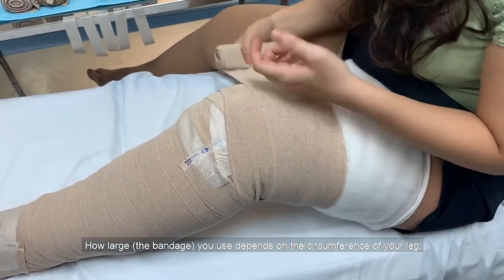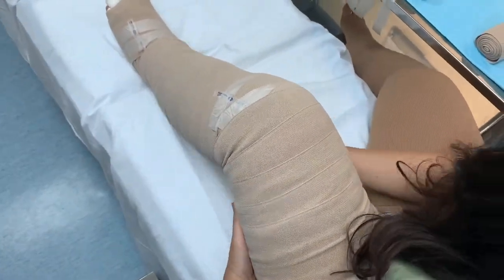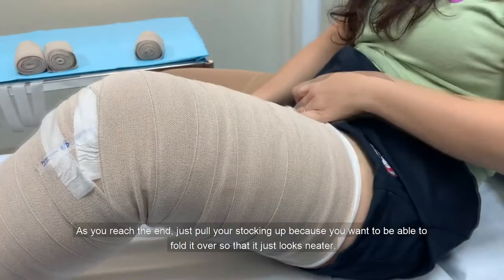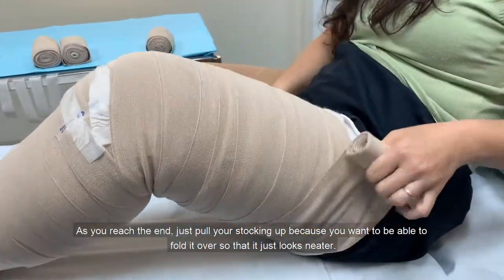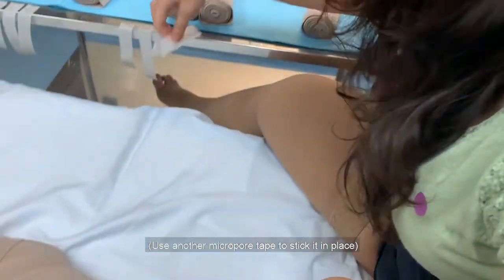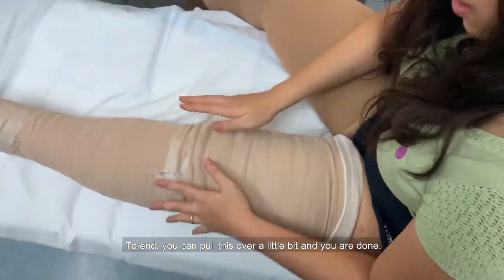How many bandages you use for the thigh depends on the circumference of your leg. It's okay if your micropore tape edges are showing. Start at the top of the thigh and work down, using the 12cm bandage. Pull your stocking up and fold it over at the top so that it looks neat. If you want, pull the stocking over a little bit at the end to finish.